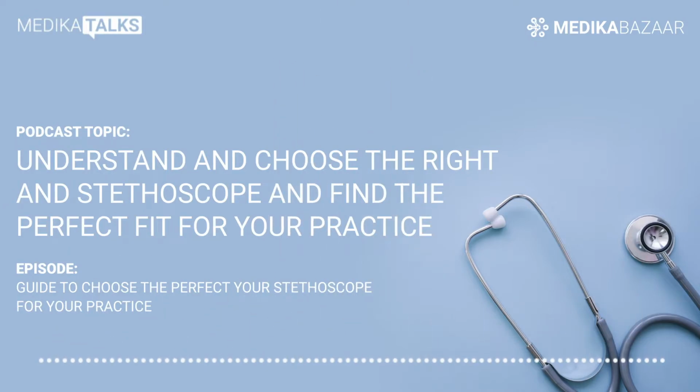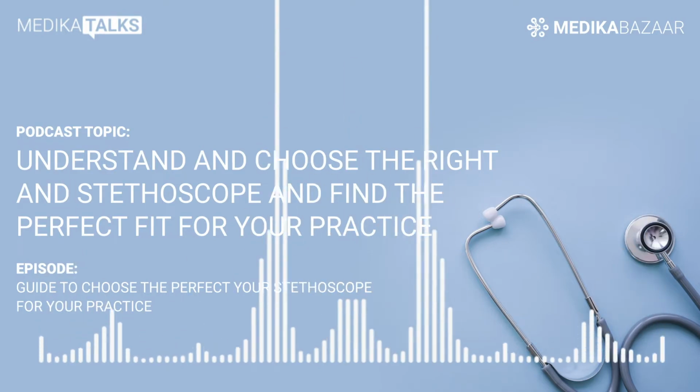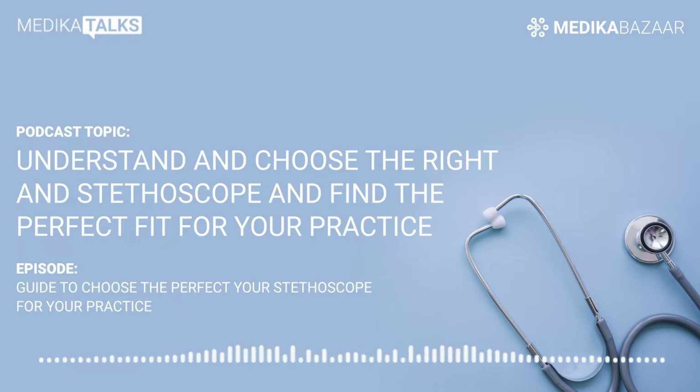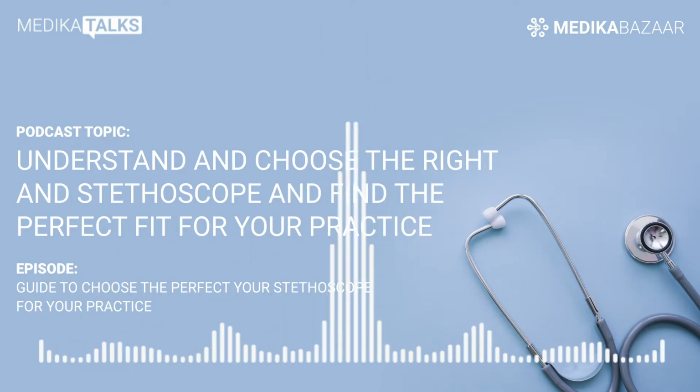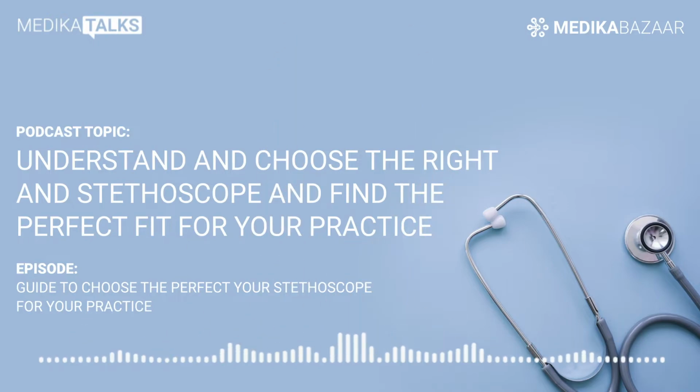Disposable stethoscope. Disposable stethoscopes and disposable diaphragms for traditional stethoscopes are used when there is a threat that the instrument is likely to be dangerously contaminated.